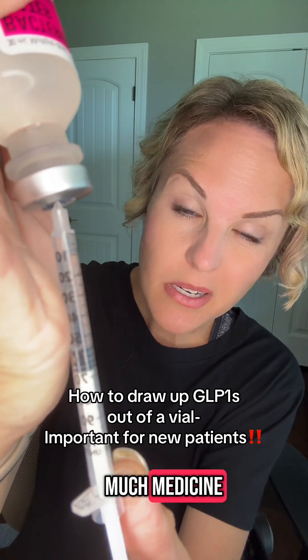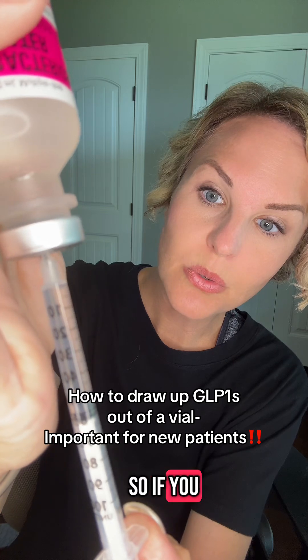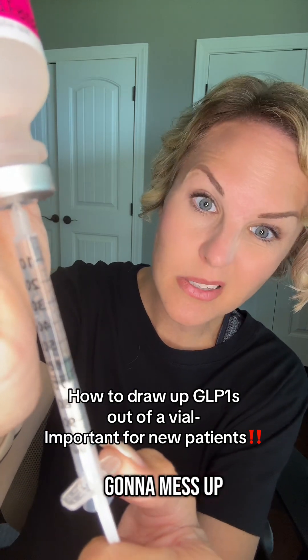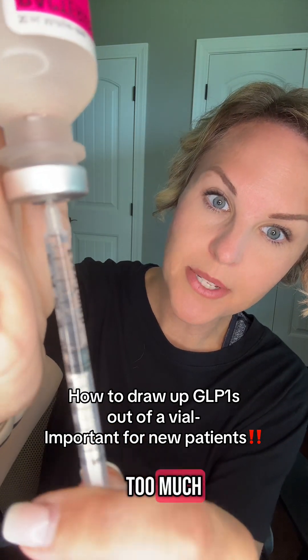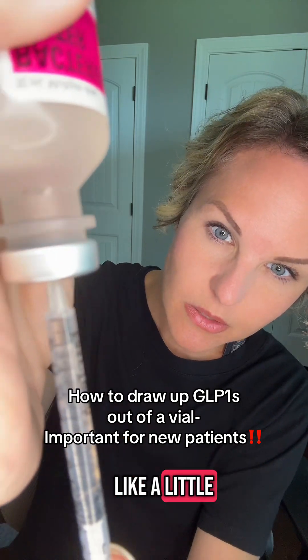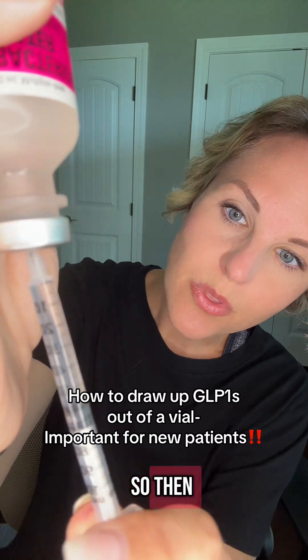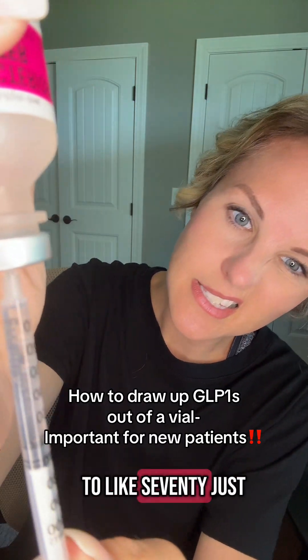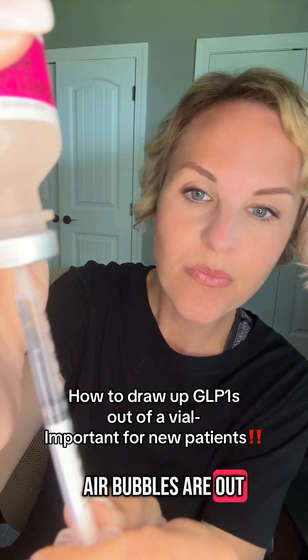Now, if you pull up too much medicine, no big deal — just release it and push it back into the vial, because the medicine is sterile. As long as you don't do anything else with it, you can push it back and pull again. A lot of the time I'll pull too much on purpose because there's always a little air at the top, and then I'll push it back to push the air bubble out. So let's say you're on 50 units — I'll pull it back to about 70, then push it back up to 50 and make sure all the air bubbles are out.